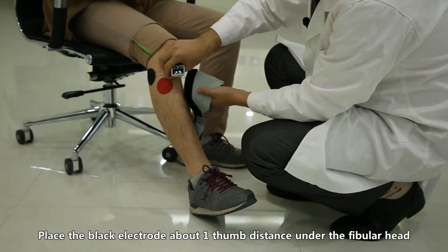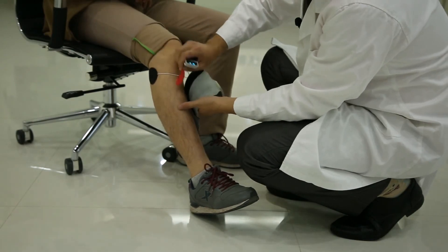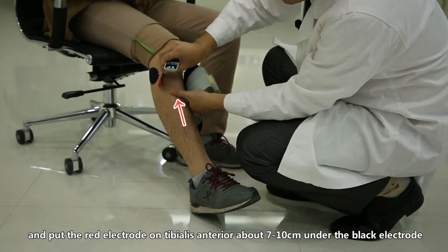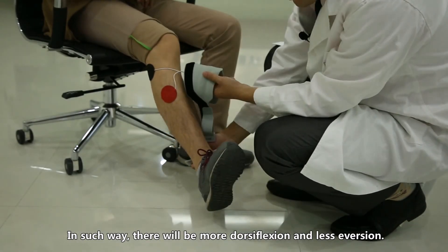Place the black electrode about one thumb distance under the fibular head and put the red electrode on the tibialis anterior about 7 to 10 centimeters under the black electrode, such that there will be more dorsiflexion and less eversion.